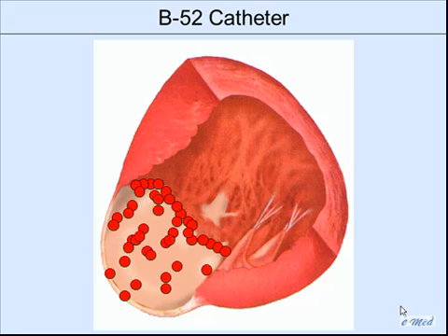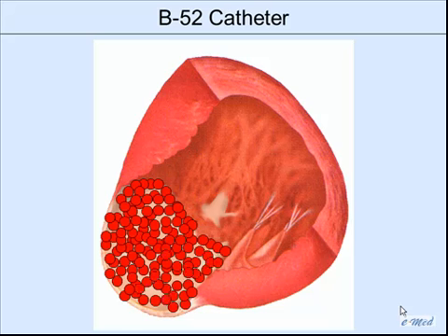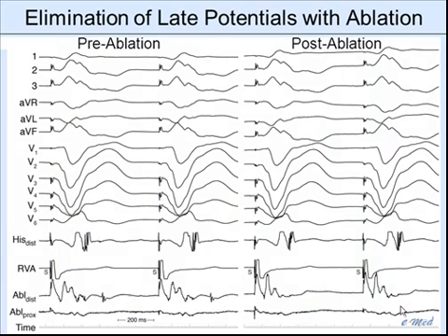And then this is the IDF, you know, comes along and now I used to think this was funny, but Natale, you know, this is what his stuff looks like nowadays. And finally, there's one dot that got in there. Ablating late potentials, that's pretty straightforward. You don't usually get quite this nice result, much like pulmonary vein isolation.